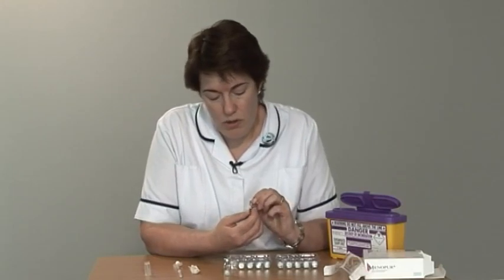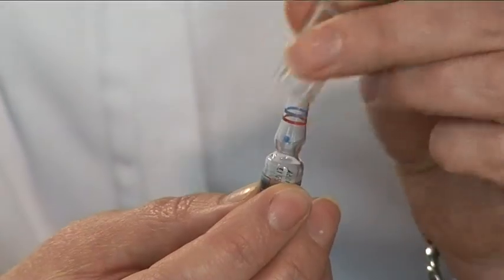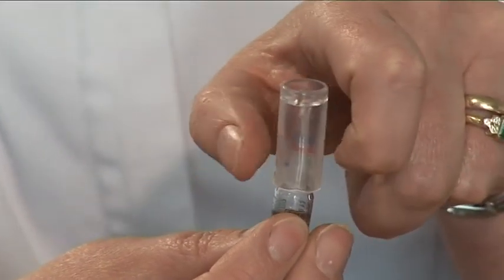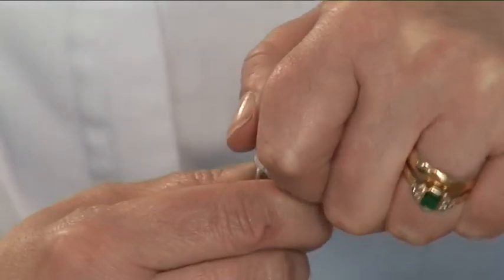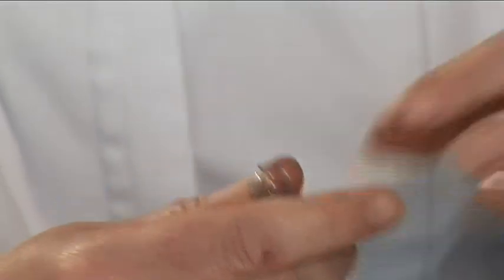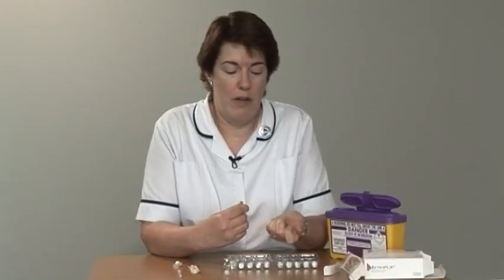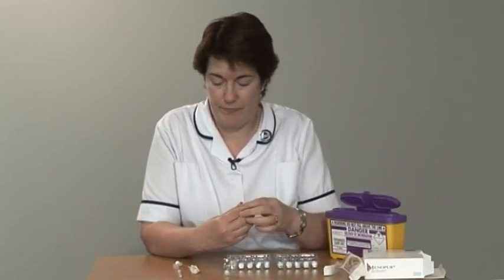In order to not cut your finger, take the plastic ampule snapper, place it over the top of the vial, place your thumb in line with the blue dot and snap, preferably away from your body. You can now dispose of the top and the ampule snapper in your sharps box.